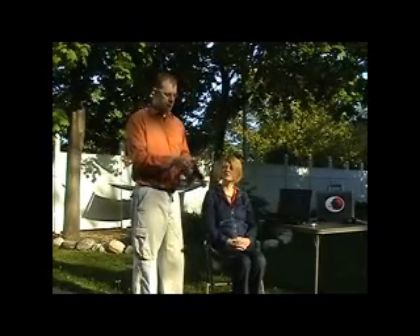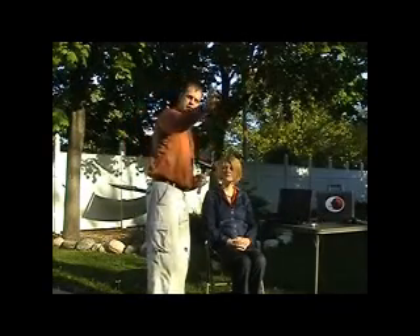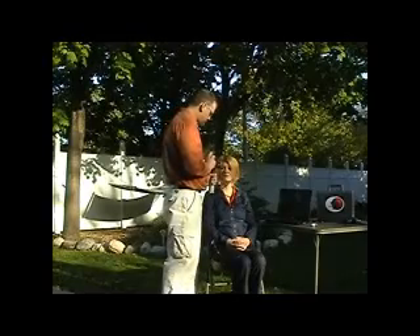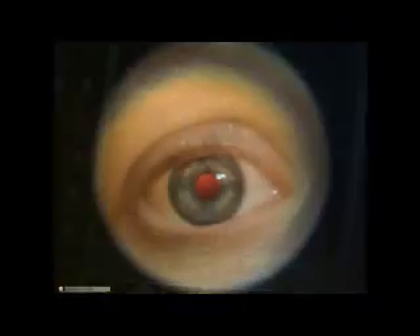To take anterior segment photos, I am going to slide the tumbler all the way into Plus. I am going to direct the patient to look straight ahead, and I am going to work from about a six- to eight-inch working distance to take my desired photo. Just like so.